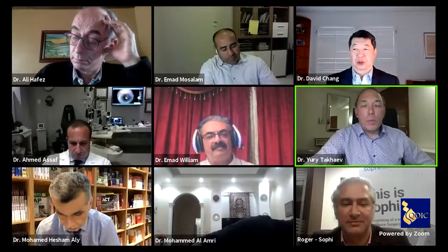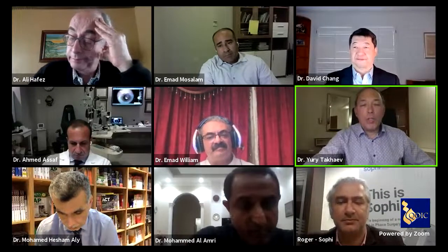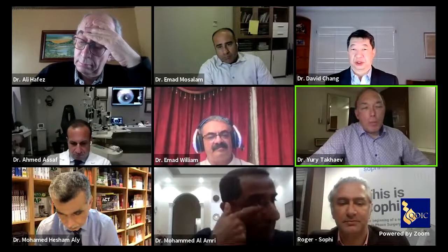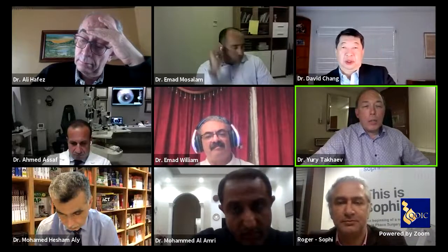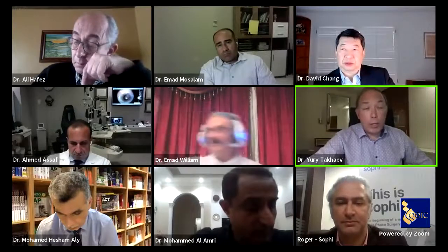And we have some very advanced technology from Alcon, with the Active Sentry, for the same reason, so we can reduce intraocular pressure and stabilize the anterior chamber at the same time. So it is a very, very important step. And it's very interesting how this pump for the irrigation line can compensate the post-occlusion surge and can reduce the intraocular pressure during surgery to the normal range.